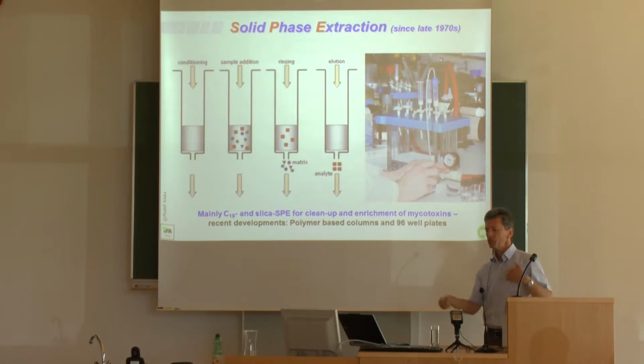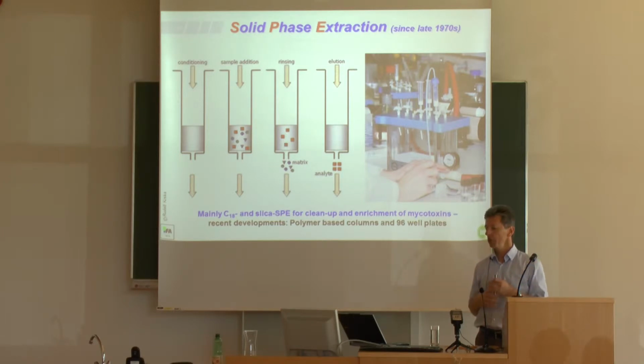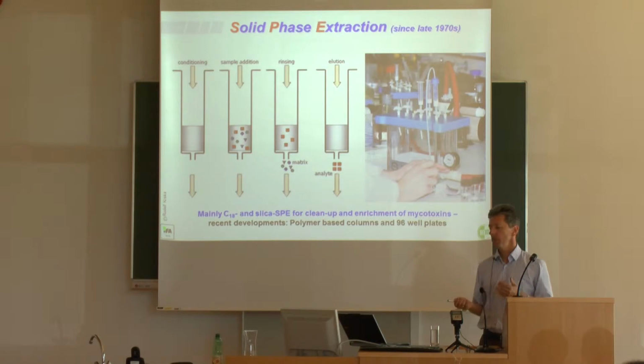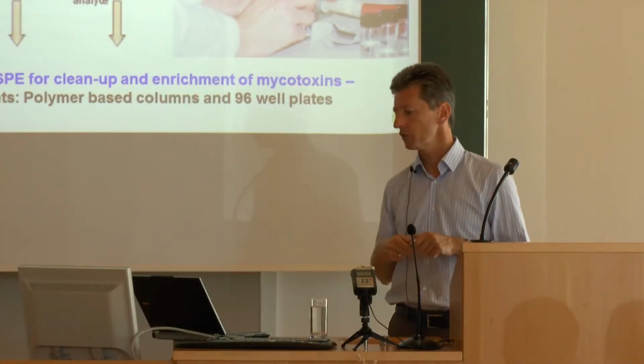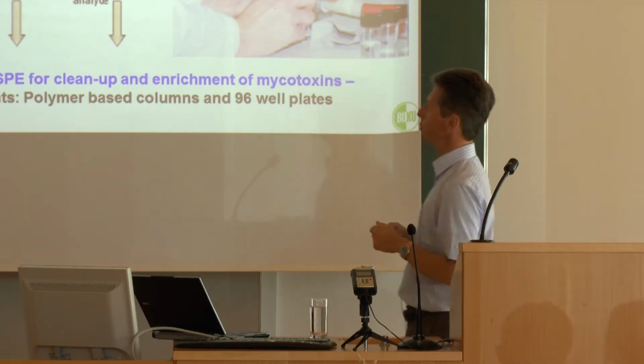Once extraction was performed successfully, and in case you are not pursuing a multi-analyte, multi-toxin approach to cover ideally a couple of hundreds of metabolites, a way forward to get rid of matrix interferences on the one hand, but also to purify and get higher concentrations of your analyte on the other hand, is solid phase extraction.